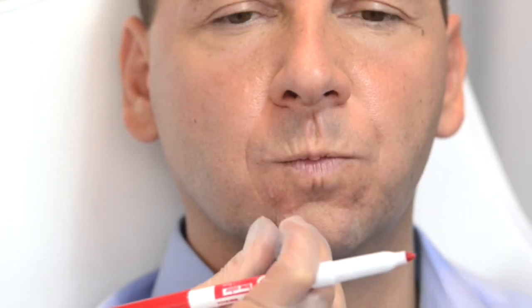Injections can also be made using a bolus technique, when the loss of volume requires greater projection, with a single bolus or two or more boluses in the central part of the chin. These boluses are injected in front of the chin for an anterior projection and in the lower edge of the chin for a downward projection.